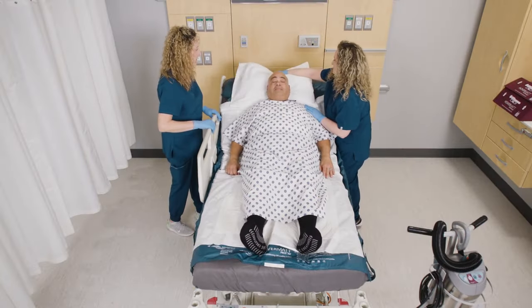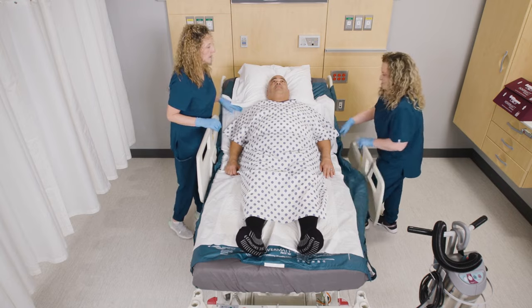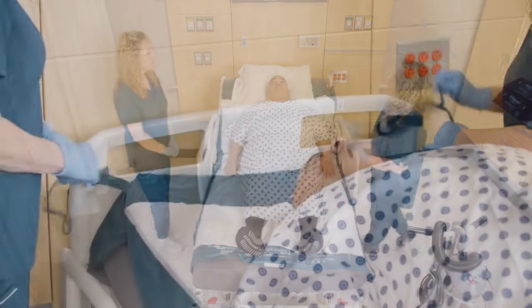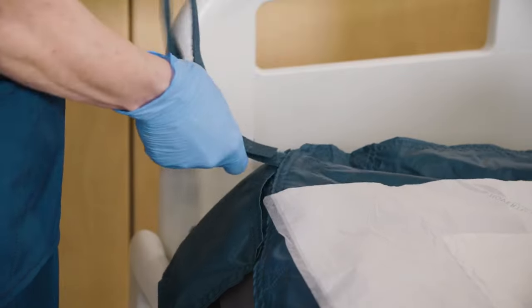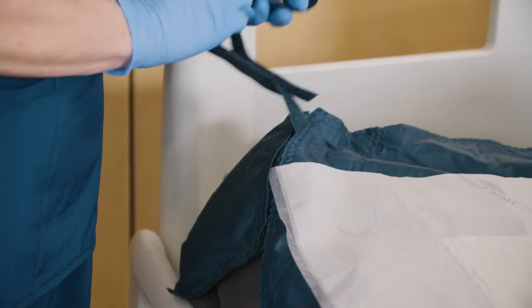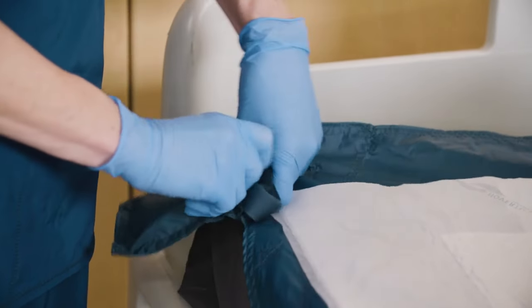Raise the head of the bed and side rails or follow your facility's protocol. Before safely boosting, turning, or transferring, disconnect straps from the bed frame. When straps are not in use, store in pockets.